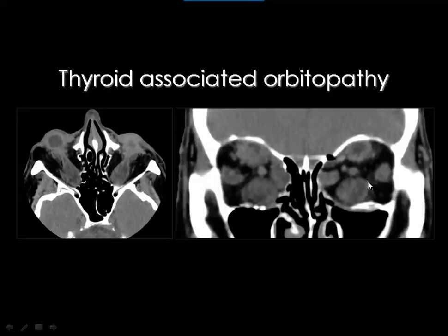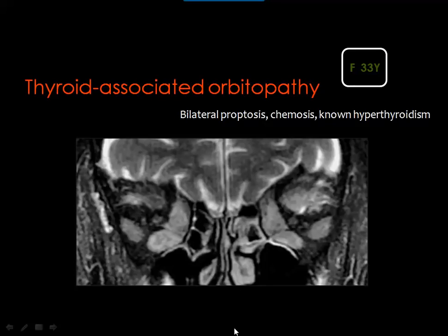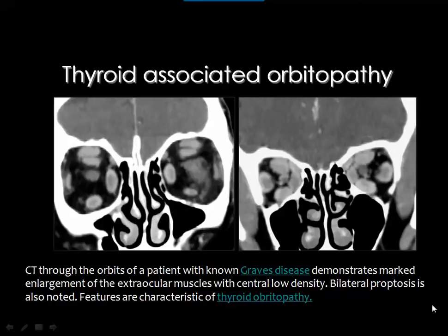In Graves' disease you can see the lateral and medial recti, inferior rectus, and superior rectus levator complex all involved. MRI T2 coronal images show Graves' disease affecting medial, inferior, lateral, and superior recti on both sides. Also known as thyroid orbitopathy, Graves' disease involves most muscles; the least commonly affected is the lateral rectus muscle. The inferior rectus tends to be most affected.